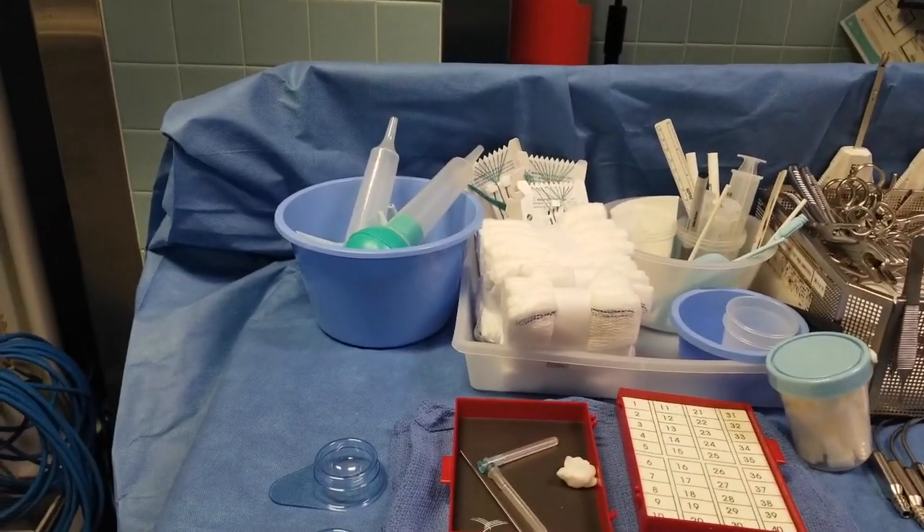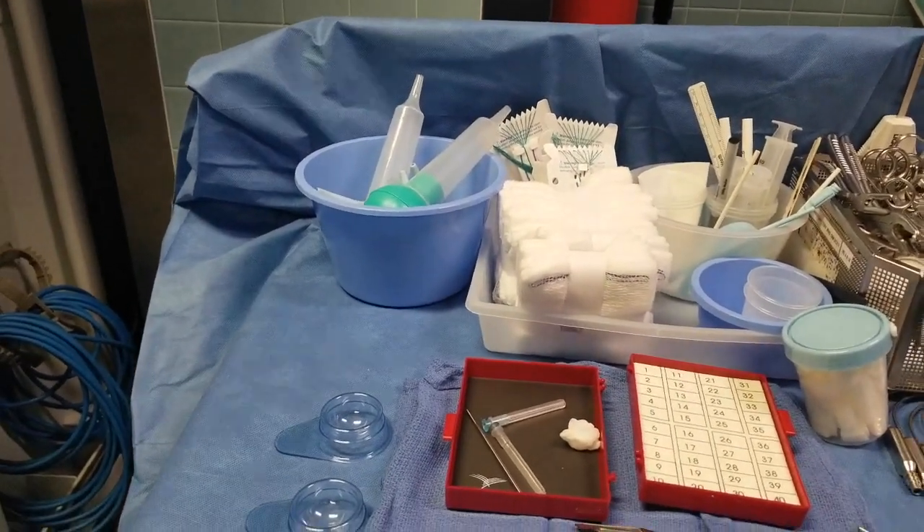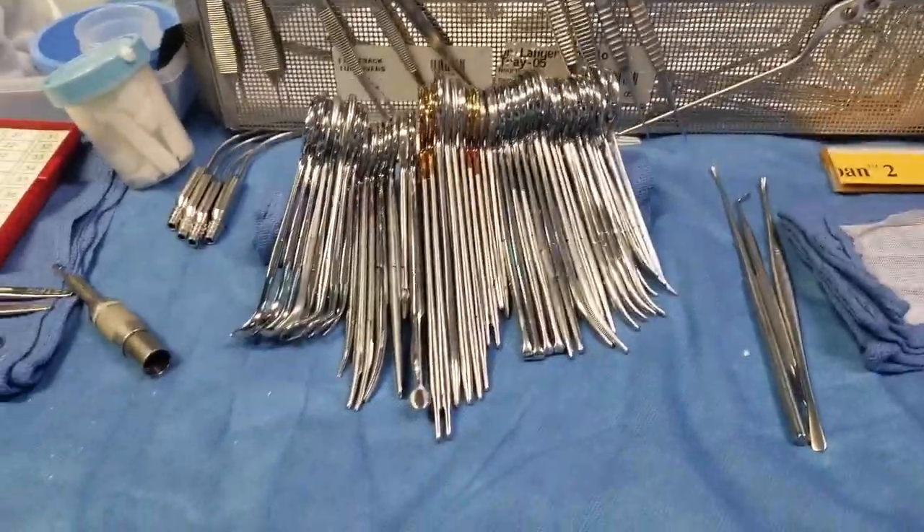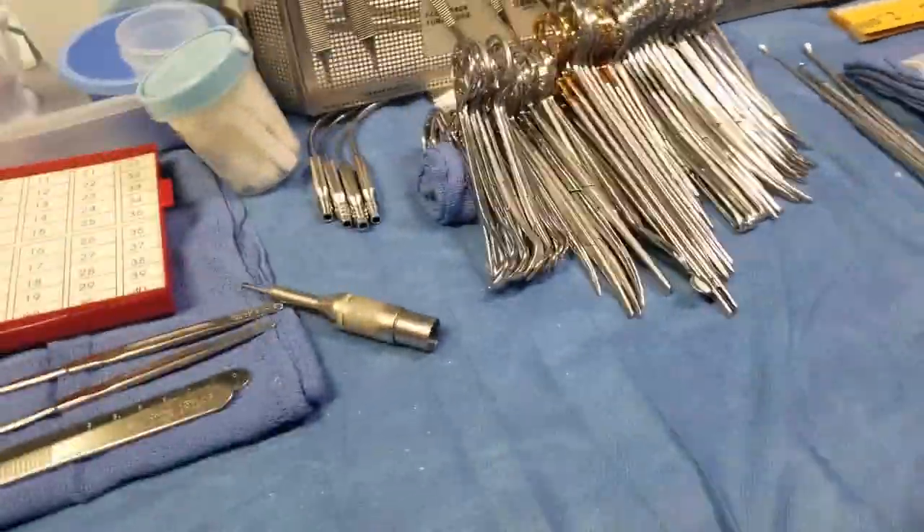Mind you, when it comes to neurosurgery, you never put any solution in your saline — just saline. Then I have my instruments laid out as shown.